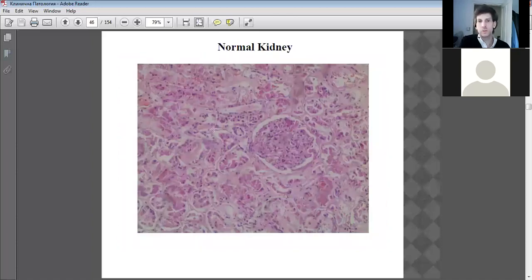This is more of a normal kidney because, again, the glomerulus is a normal conformation, a nice bow shape, and mostly roundish in shape, and also lots of nuclei, lots of red blood cells, lots of capillaries, fairly normal structure there.